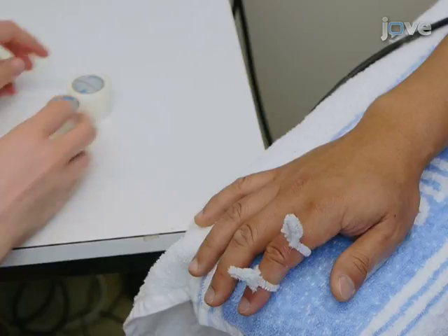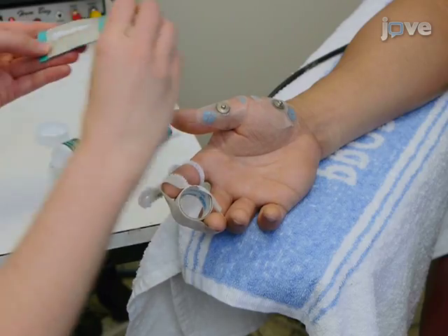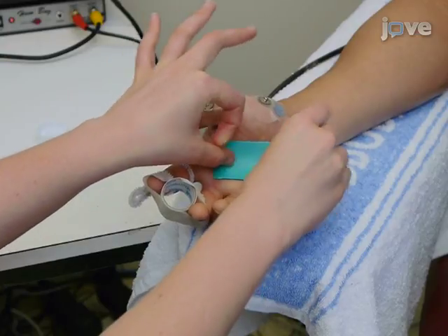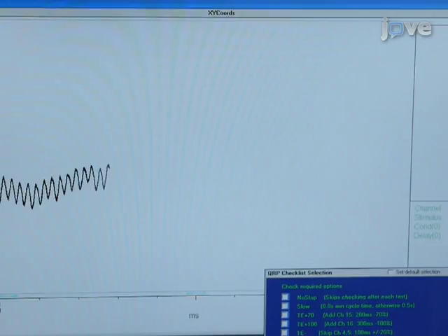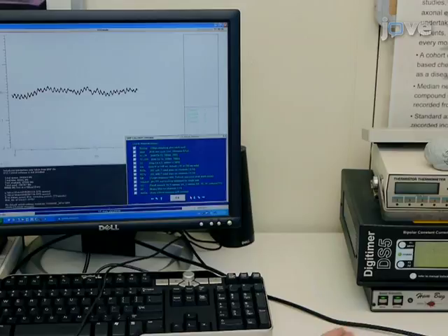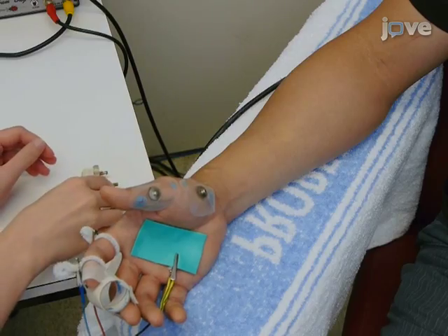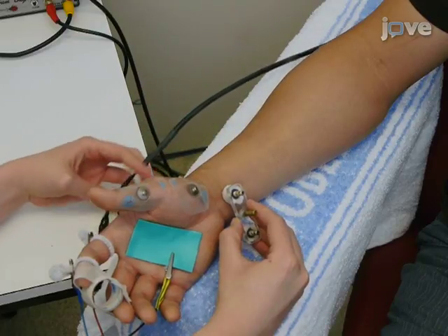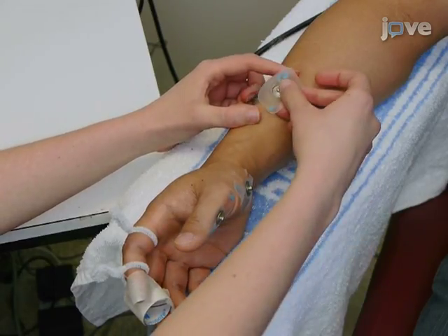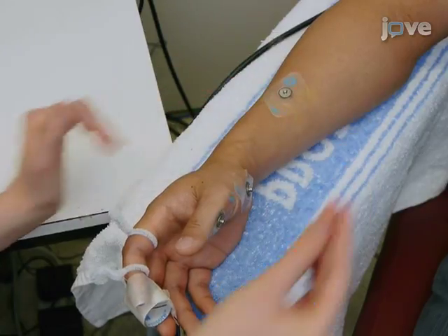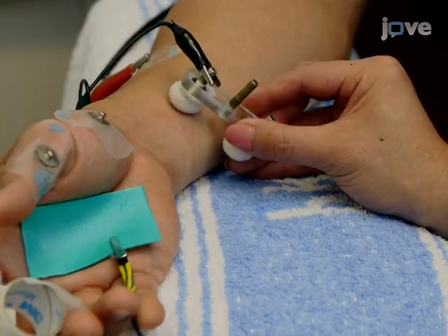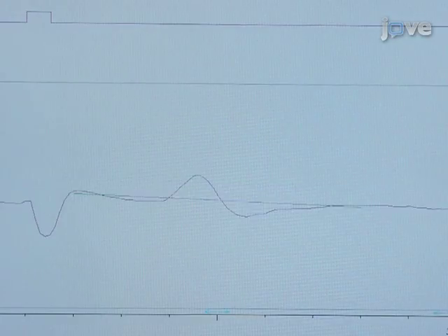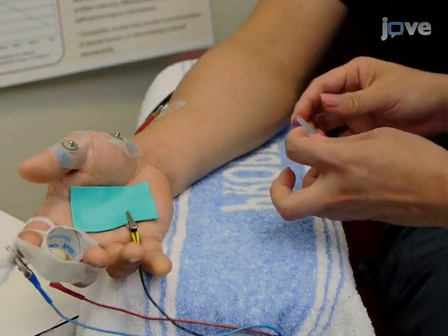Place ring electrodes to record compound sensory action potentials. Also place an electrosurgical neutral earth plate in the palm with conductive gel, and tape the fingers to stabilize them. Be sure to remove as much electrical noise in the recording setup as possible using a humbug 50 Hz to 60 Hz noise eliminator. Then place a repositionable stimulating electrode at the median nerve at the wrist, and place the anode electrode 10 cm proximal from the stimulating electrode over bone. Stimulate the median nerve and use the repositionable bipolar electrode to locate the site of lowest threshold, which will be used as the stimulation site for subsequent steps. Once the site is located, place a non-polarizable electrode.